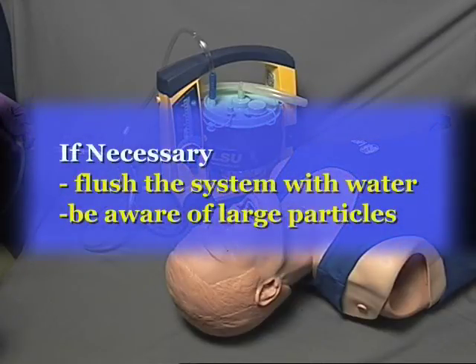If necessary, flush the system with water between suctioning attempts to ensure adequate suction at the tip. Also be aware of large particles, such as pieces of food, that may obstruct the suction catheter.